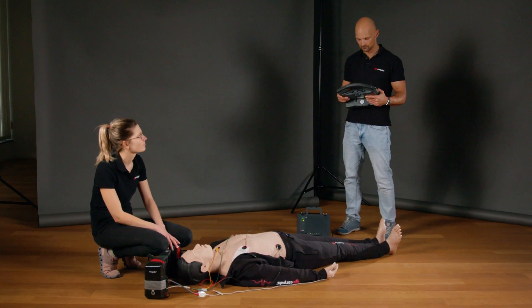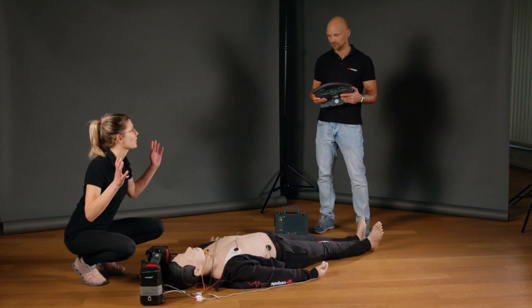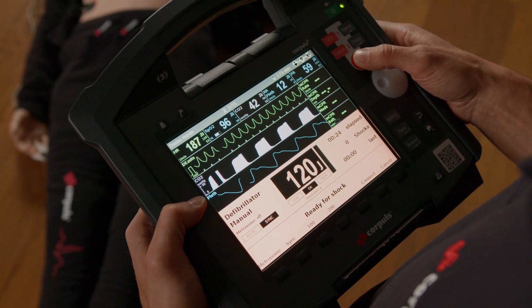The energy is prepared by pressing the charge button. Attention, we are cardioverting the patient — everyone away from the patient. By pressing and holding down the shock button, the energy can be delivered.